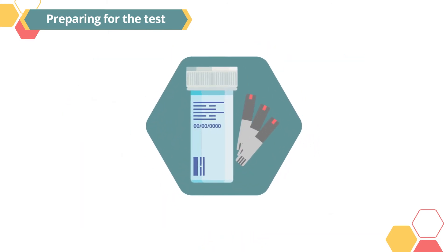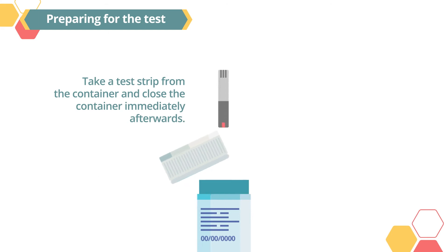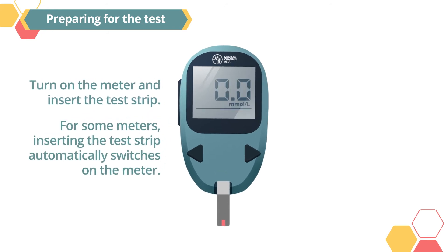Before you use the test strip, check the expiry date on the container. Use only test strips that are not expired. Take a test strip from the container and close the container immediately afterward. Turn on the meter and insert the test strip. For some meters, inserting the test strip automatically switches on the meter.